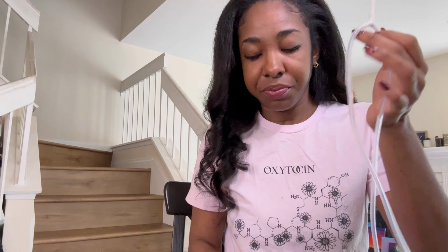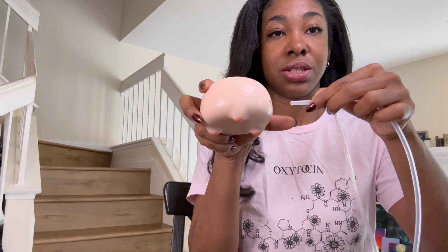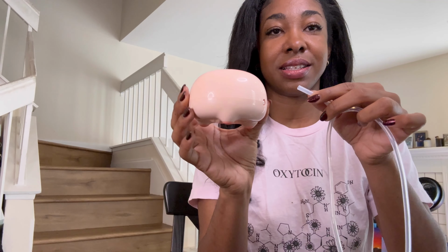So this is our Y tubing here that we've created. We're now going to attach this little tube to this little hole here. It looks like a piggy. This looks like the booty. I'm super silly today. So we're going to attach this little plug here.